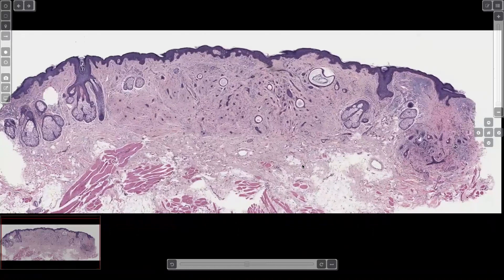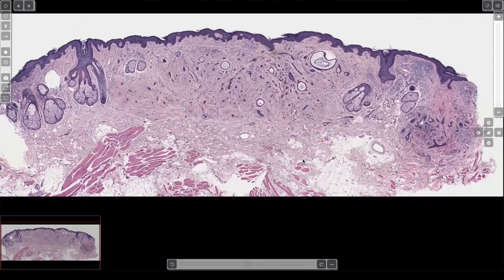Here is a skin section — you can identify location by hair follicles and other clues. Skeletal muscle is usually below the fascia, which is below the subcutis, which is below the dermis. So anywhere else in the body you have to go very deep to reach skeletal muscle. If you see skeletal muscle up into the dermis, you're almost always on or near the face, the platysma of the neck, or the scalp. It's good to learn those little clues.